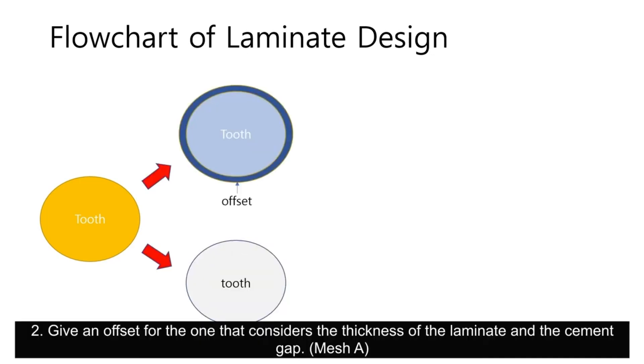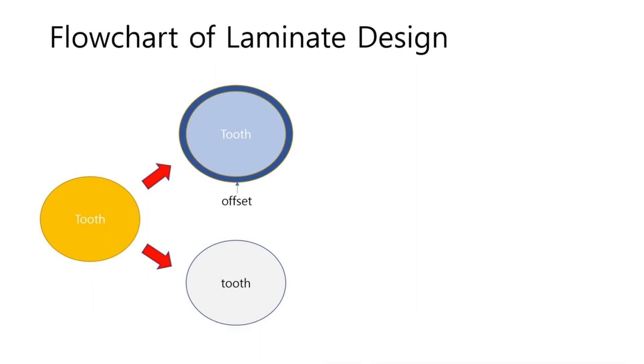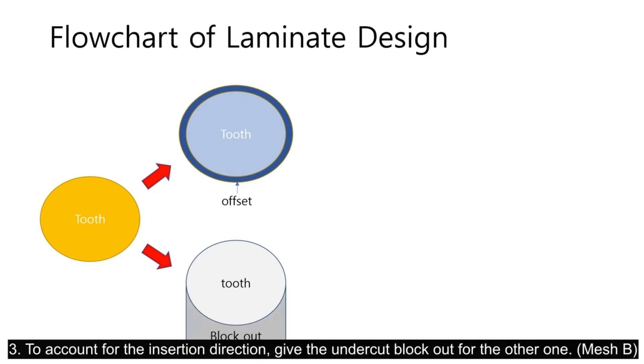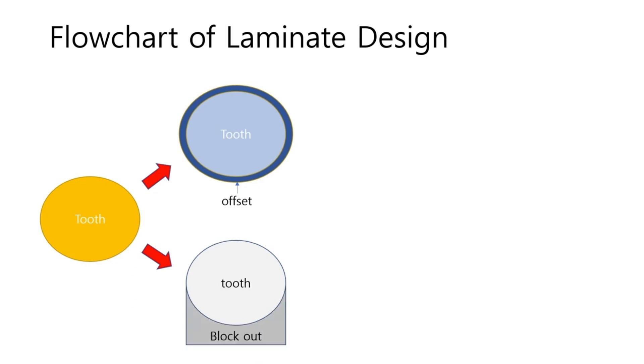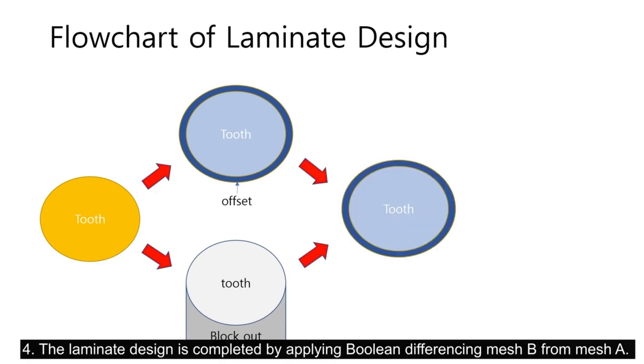Give an offset for the one that considers the thickness of the laminate and the cement gap. To account for the insertion direction, give the undercut block out for the other one. A laminate design is completed by applying boolean difference with mesh B from mesh A.